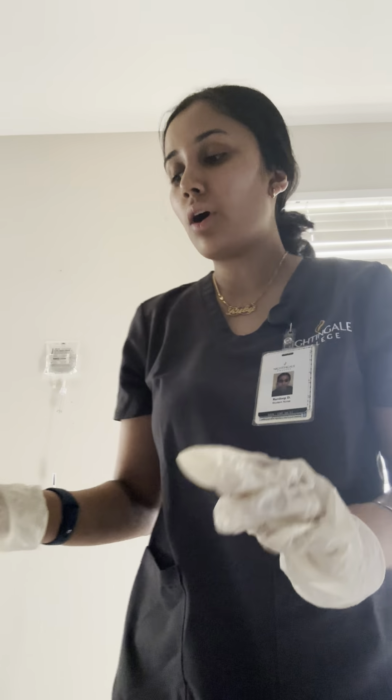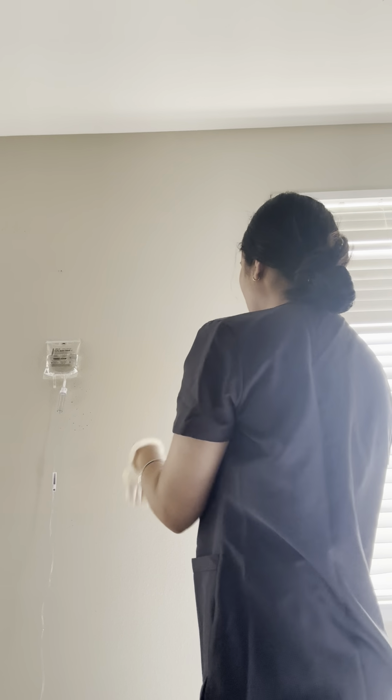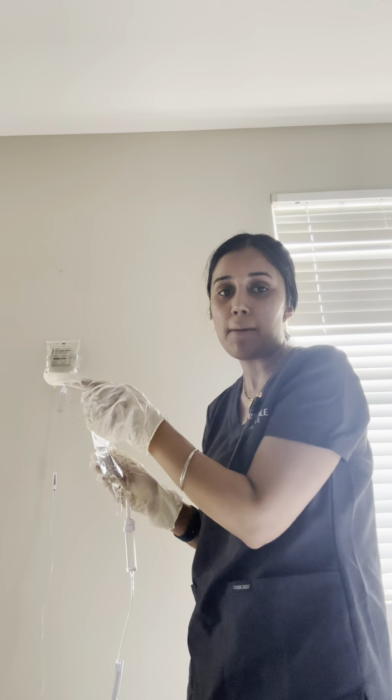And once that is secured, before we hang up the fluid bags, one thing you do change is the position of the primary fluid bag and the secondary fluid bag. So the secondary fluid bag will go above the primary fluid bag.